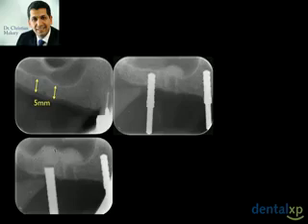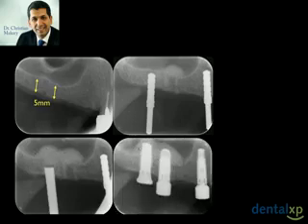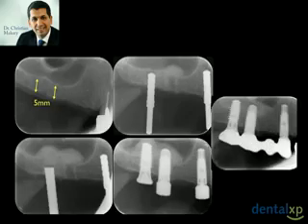That is the biomaterial that is very nicely packed by the Schneiderian membrane, and this is the implant. Those 2 implants were placed, and this is the situation today. You can see the nice amount of bone graft. We had 5 millimeter, and it went all the way to something like 10 or 12 millimeter of new residual bone height below the sinus.